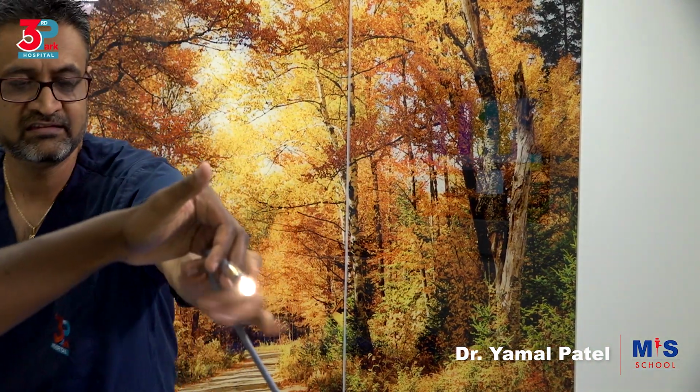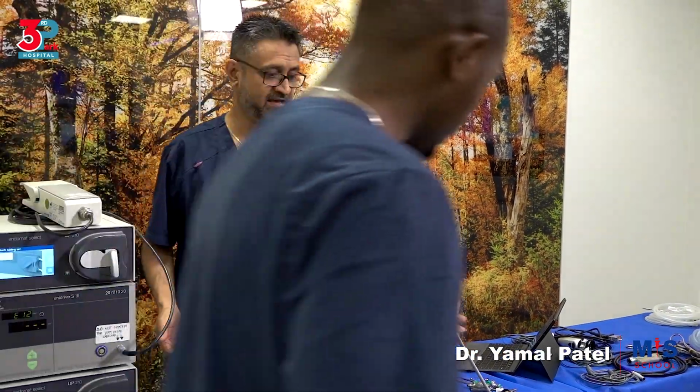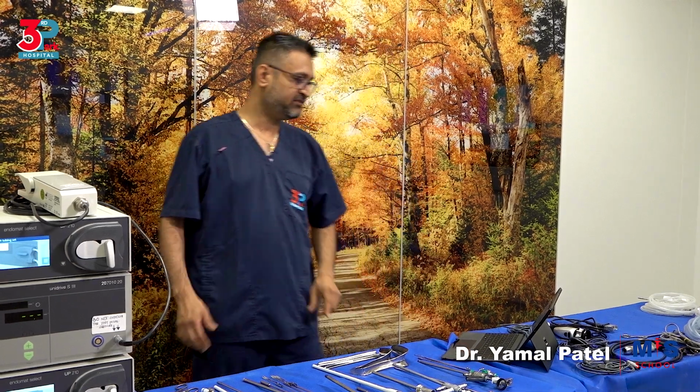That is a light source. You can use a fiber optic cable that will connect from the light source all the way to the tower, to your equipment. So we'll be connecting that as we move on, as I show you. But that's briefly about the light source.